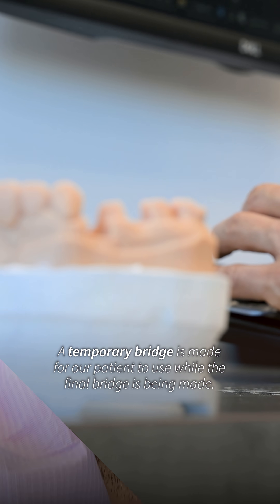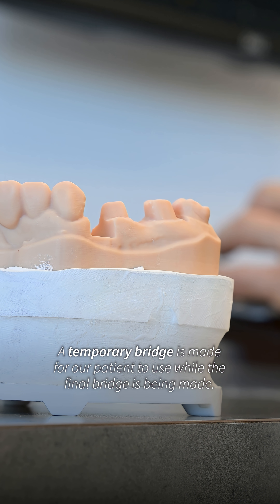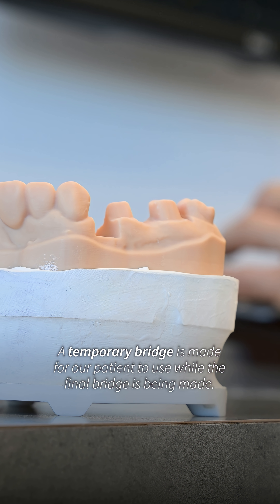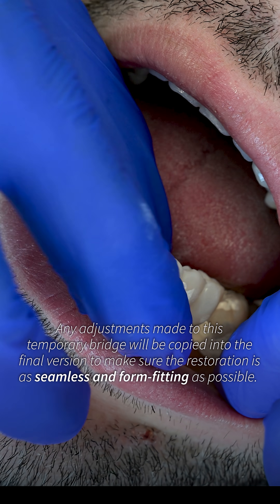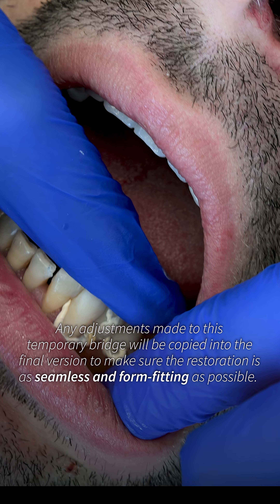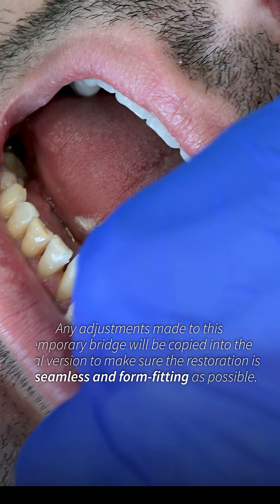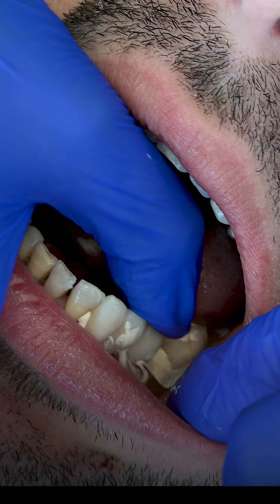A temporary bridge is made for our patient to use while the final bridge is being made. Any adjustments made to this temporary bridge will be copied into the final version to make sure the restoration is as seamless and form-fitting as possible.